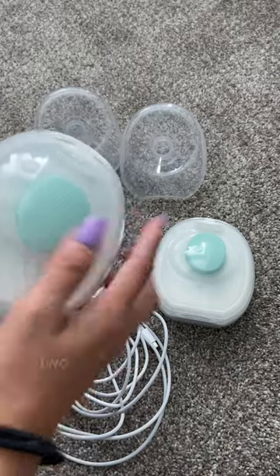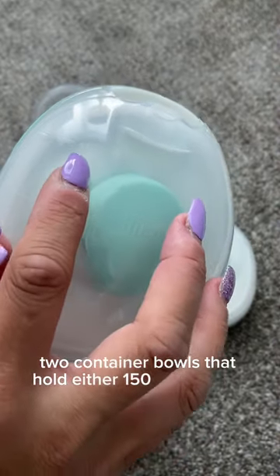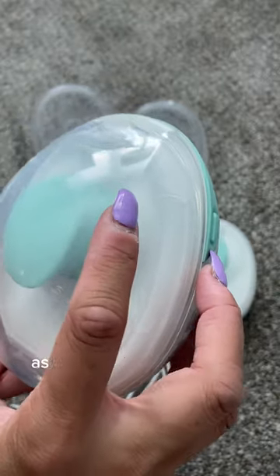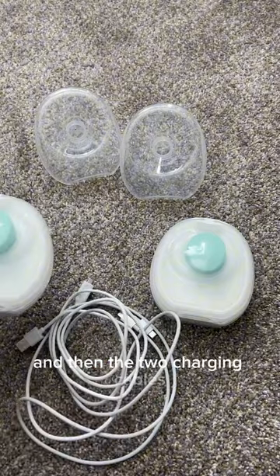There are two diaphragms, two container bowls that hold either 150 milliliters or 5 ounces, and then the two charging cables.